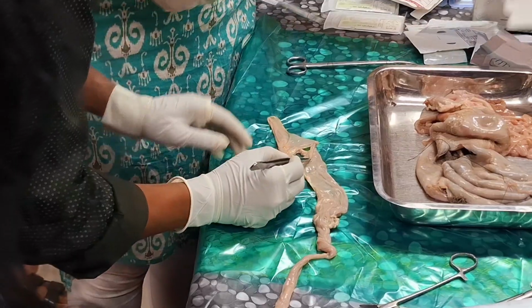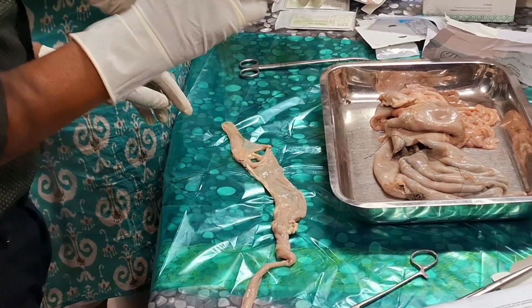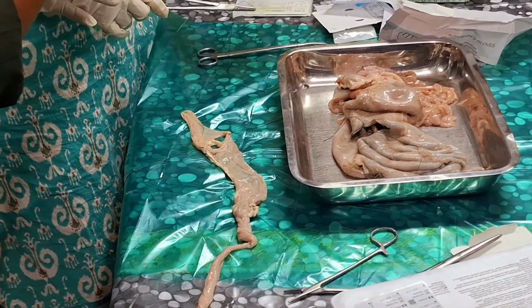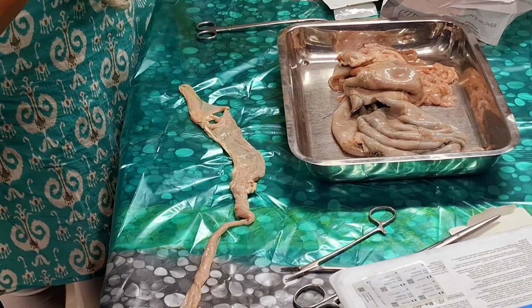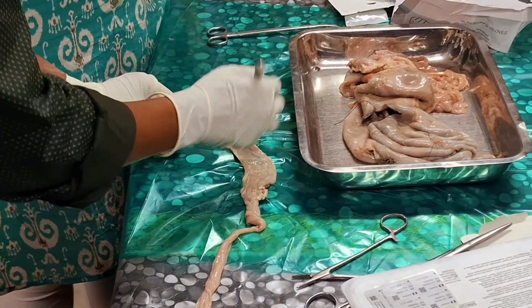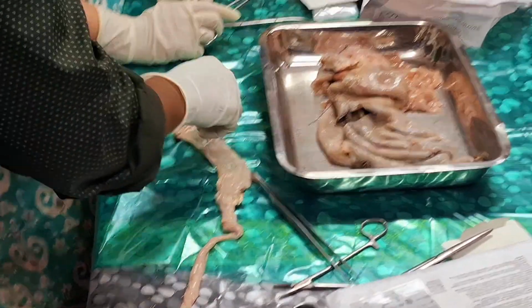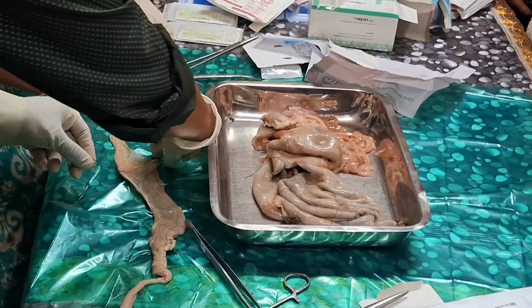When you do a single layer suture, it should be interrupted. You cannot do a continuous suture in a single layer, because the entire suture strength will depend on the final knot. So whenever you do a single layer suture, you should do interrupted sutures, with serial bisection of the distance, then again the next one, subsequently bisecting the distance.